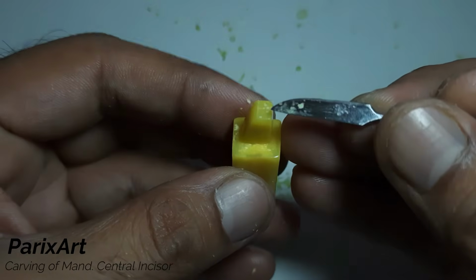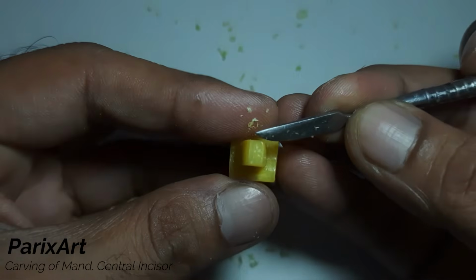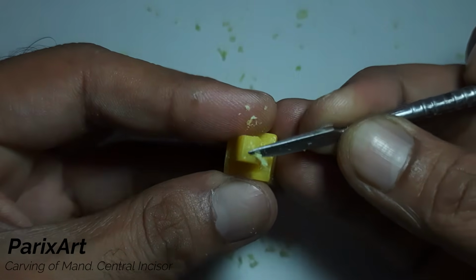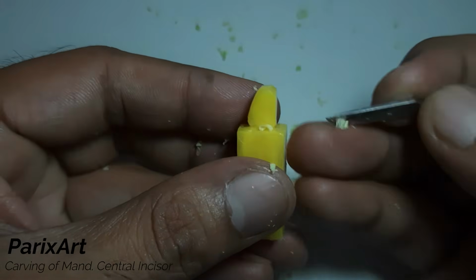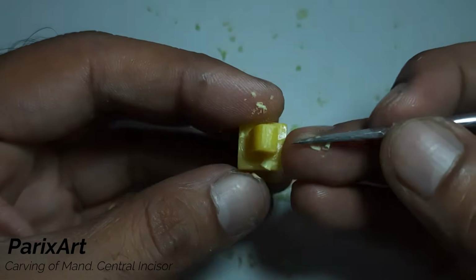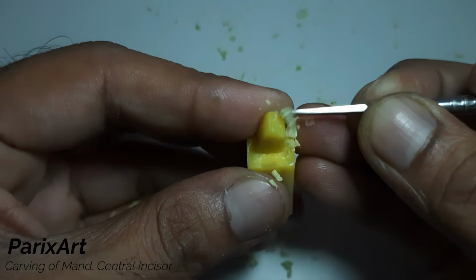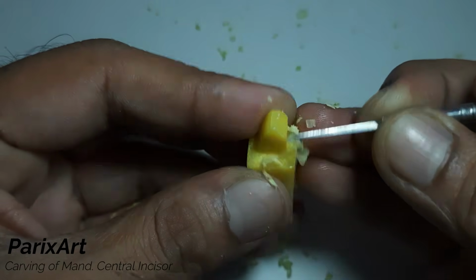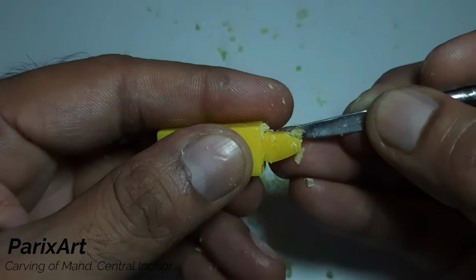We know the incisal edge stays to the lingual and is slightly rounded off. So let's carve. First closing into the incisal edge to make it thin and straight from the incisal view. Start developing the straight outline till middle third. Also keep in mind the incisal is to the lingual.